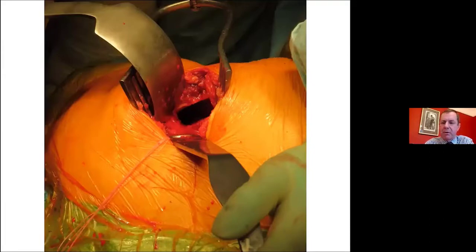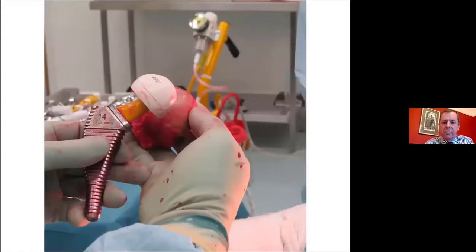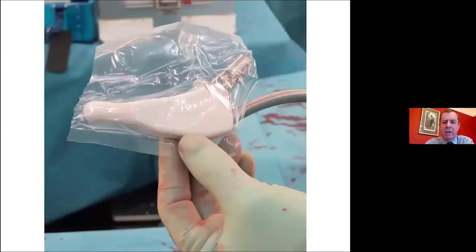I use exactly the same approach when I was doing the old Furlong. Again, my intraoperative measures. In this case, I'm using a 133 degree high offset with a 40 medium head. I use the plastic bag that the implant comes in to avoid it touching the skin edges on the way into the patient.